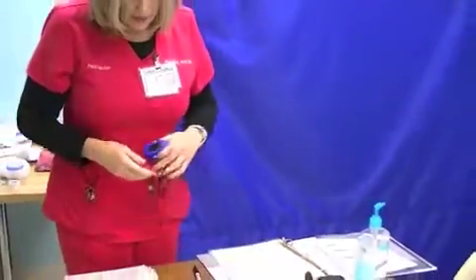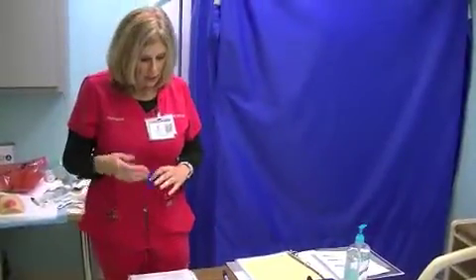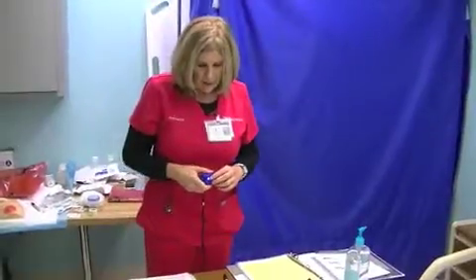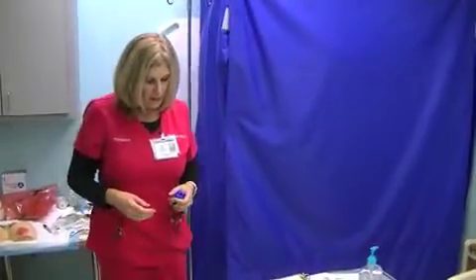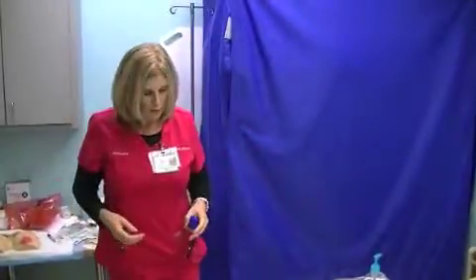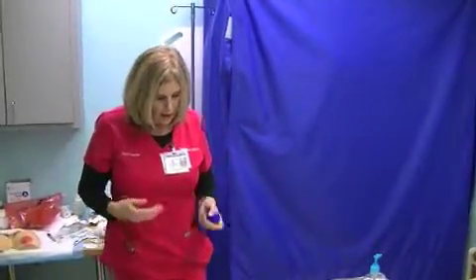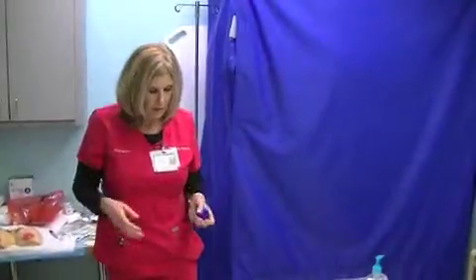And also we're going to make sure the patient's free of artificial nails. There's no nail polish, because if they have decreased oxygen saturation, the nail polish will hinder the reading. We also need to assess for factors that affect pulse oximetry. One of them is low temperature, what we call hypothermia. Also hypotension, because they don't get good blood flow, and it will cause inaccurate readings. And if the patient has tremors, it will show up as artifact and they won't get a good reading.